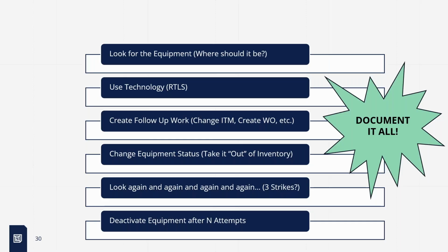One, form a committee, even if it's just within your department, of the people who are going to manage those. Limit who can add new manufacturers or new companies. GE is a great example. You see GE, you see General Electric, you see G.E., and some with different capitalizations, capital G, lowercase e. You've seen them all. Those are bad ones. I just saw one on the facility side, Bell and Gossett. They make a pump, and it was spelled 19 different ways in the system. So definitely have a way to standardize those.